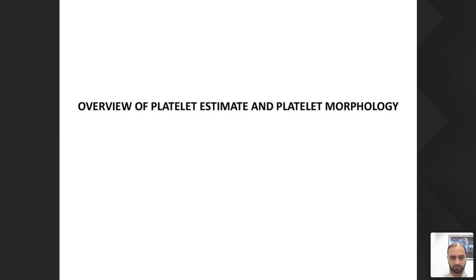So not only that, when an analyzer gives you a count of less than 1 lakh, you always tend to search for hemoparasites, you always tend to search for any atypical leukocytes. You tend to go through the flags or the scattergrams. So with a low platelet count less than 1 lakh, the slide consumes more time because you know there are no flags. It was just a giant platelet flag, but still, because the counts were low, you go into the slide, you check for the WBC abnormalities, you check for any hemoparasites. You do a manual platelet estimate, ideally 20 fields in oil immersion, doing an average, multiplying it by 15,000 or 20,000 as per the SOP of your lab, and then you report it out.